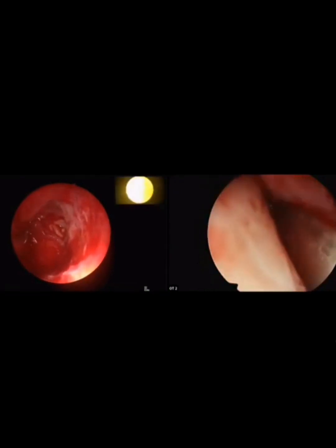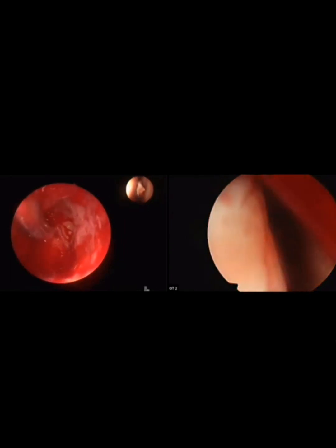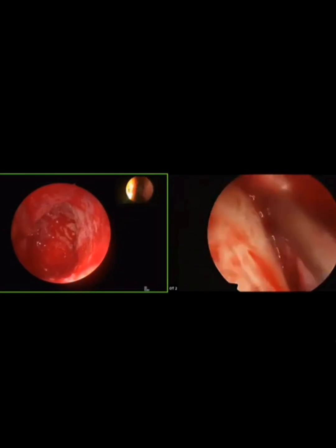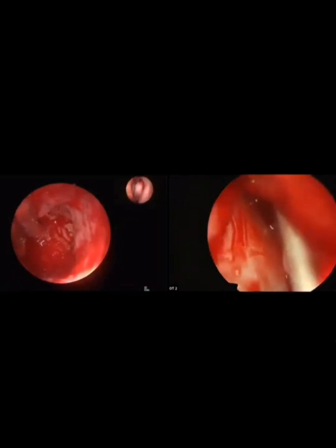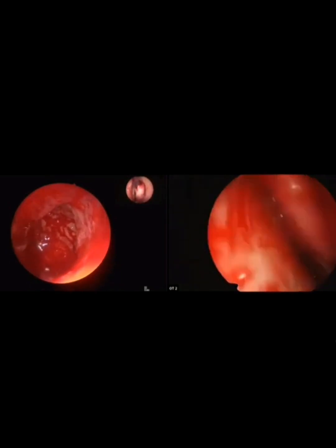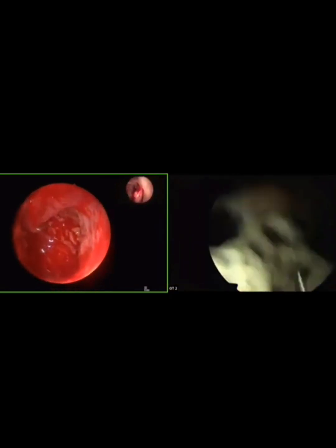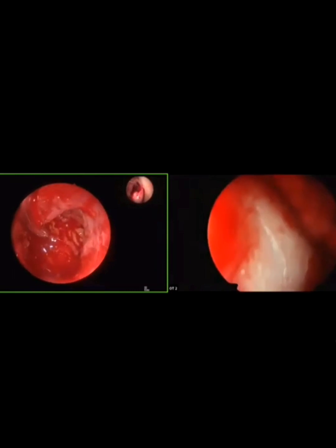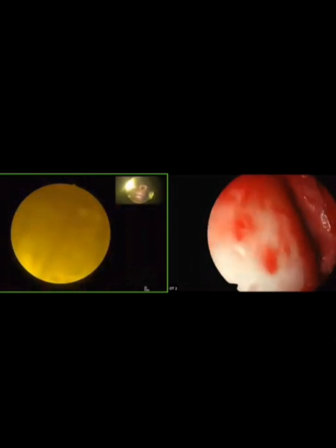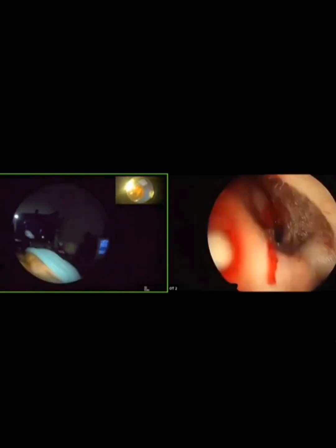Any questions for septal surgery? This is 120-degree blade. Okay. We can reach the corner of the maxillary sinus laterally with this blade. Lateral angle. Good, very good. I am using 120-degree blade. Okay. Suction. 60-degree blade.